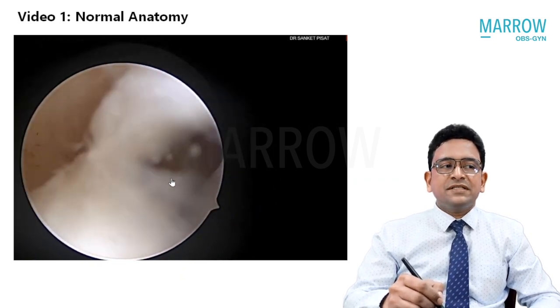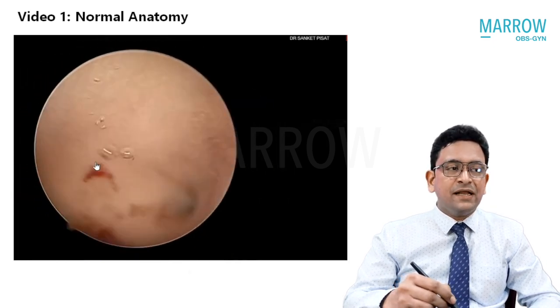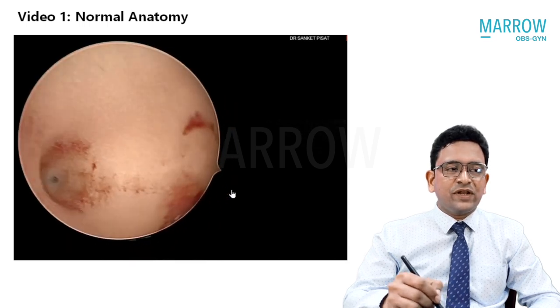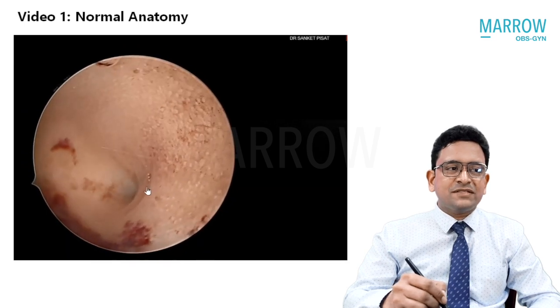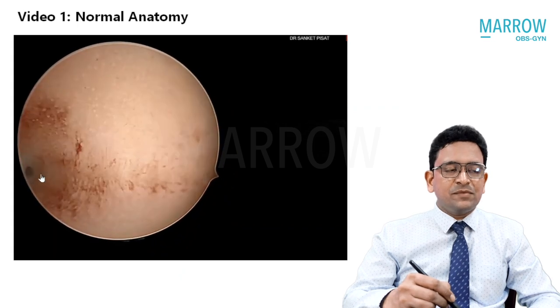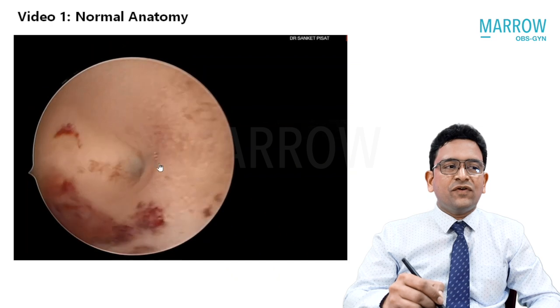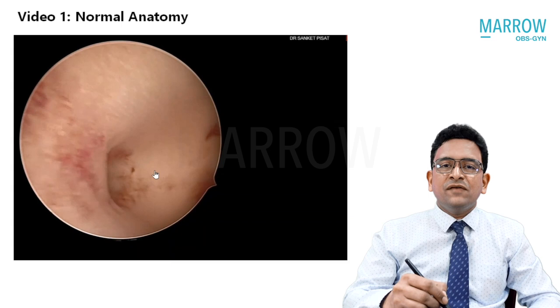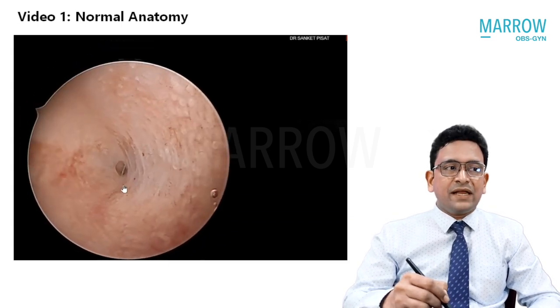Once you have negotiated the internal os, you find your way into the uterine cavity. The interior of the cavity shows two ostia on either side — this is one ostium and this is the other ostium. The fundus over here is reasonably flat. There may be a very slight inward indentation of the top of the uterus, which can be called an arcuate uterus — basically a variant of normal that does not require any treatment.